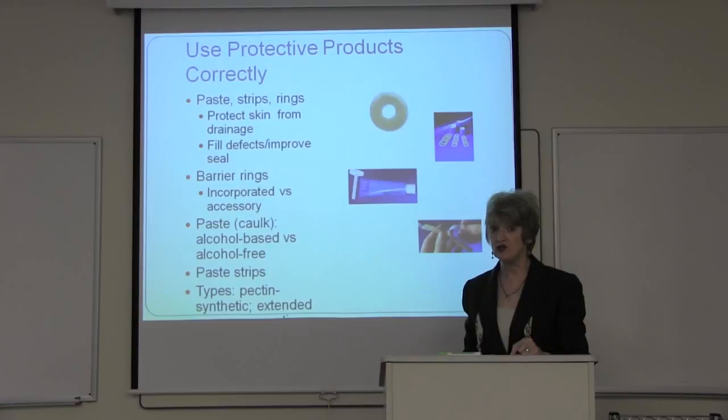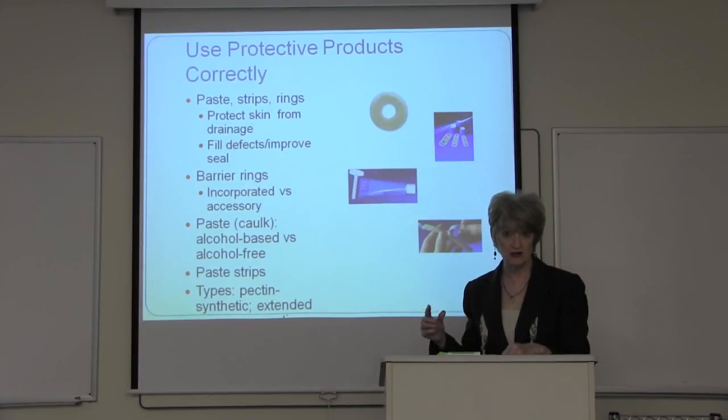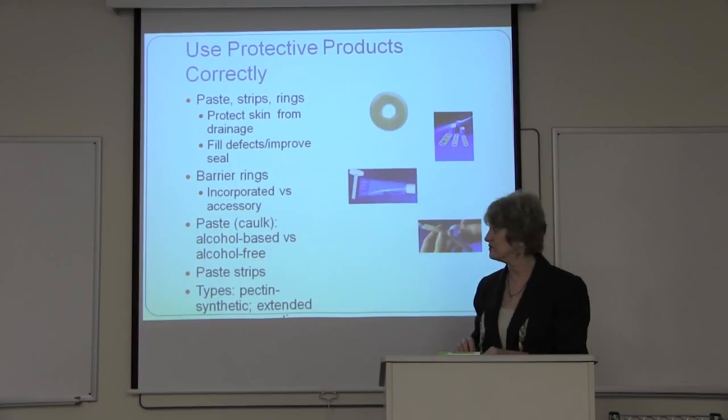So if you have a patient with an ileostomy, it's not going to be enough to use one of your skin sealants. You also need a barrier product, something that goes on top of the skin and that separates the skin effectively from that enzymatic high volume drainage.